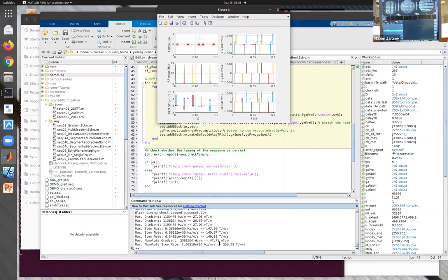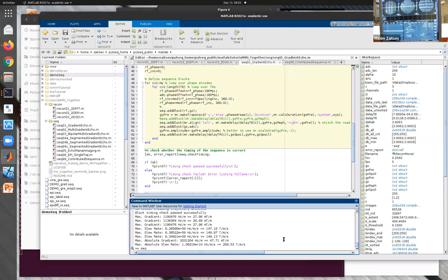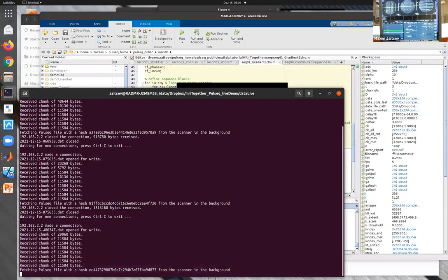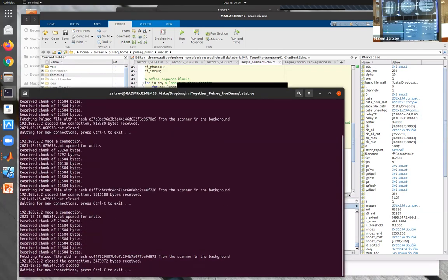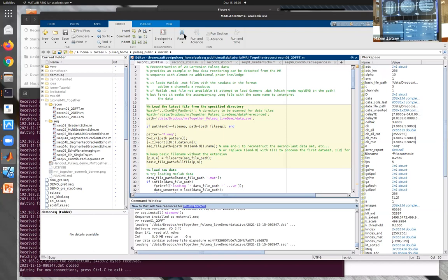In the meantime, I clone the sequence on the scanner. I do sequence install. So the sequence is now on the scanner. We scan, and you see now the inner loop changes the timing, which makes the sequence sound so strange. You also see something is happening in this window. So we receive the raw data now and can throw it at the recon.